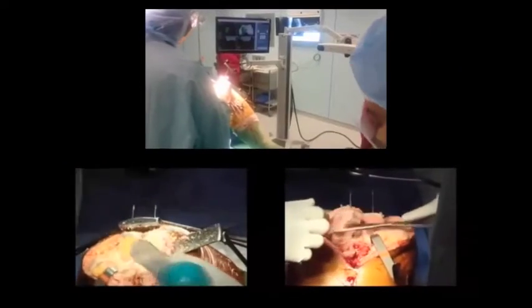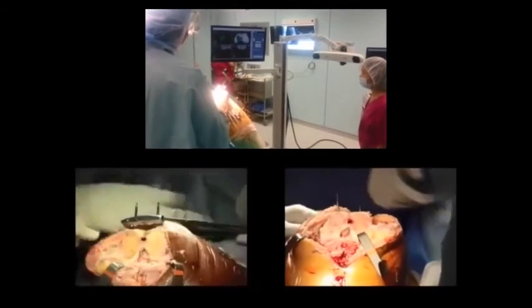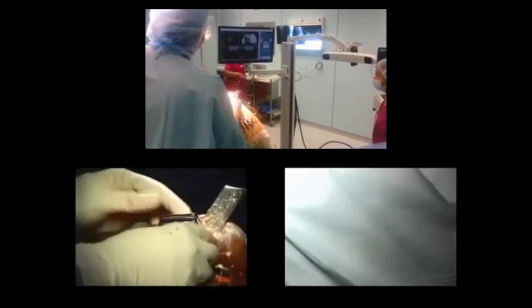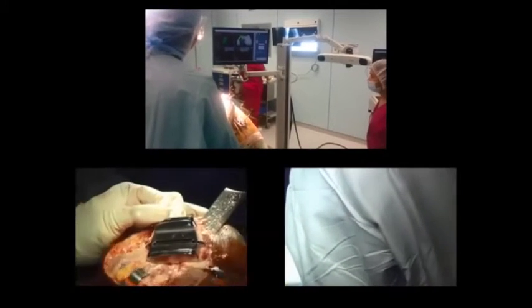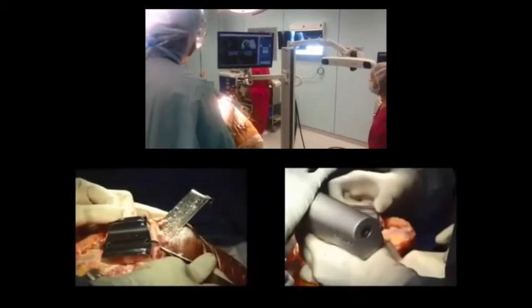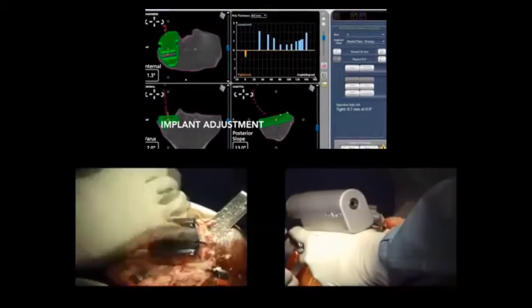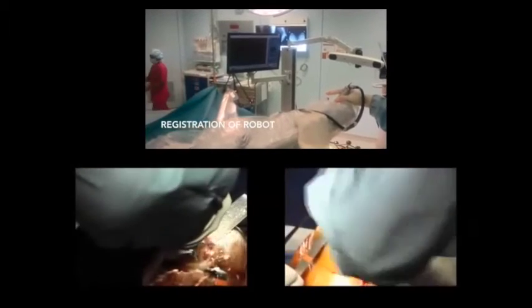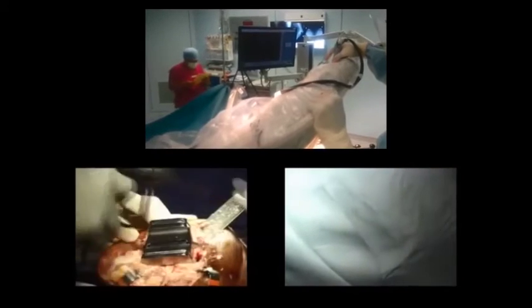At the top you can see the yellow areas — that's cartilage — and what we are doing here is mapping the patient's cartilage onto the implant. Of course in a total knee replacement there is no such concept; it tends to be more centered around implant-specific rather than patient-specific considerations. Here we see adjustment of the implant in the virtual space, and now we are registering the robot.